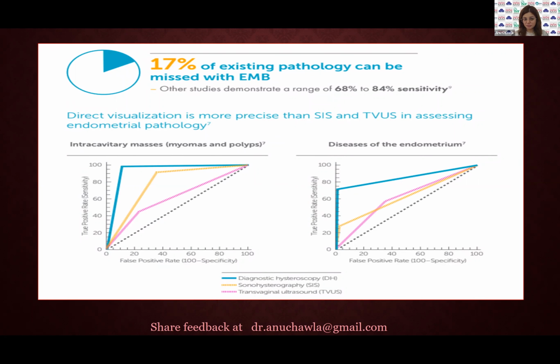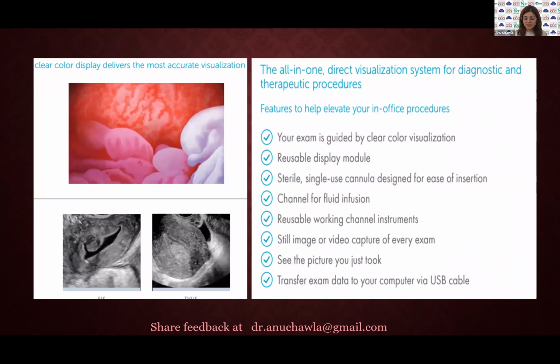17% of the existing pathology can be missed if we do not actually go into the uterus and we use the other modalities of investigation. Plus there is color. We are actually really going in the cavity. There's a colored image. The resolution is fantastic.